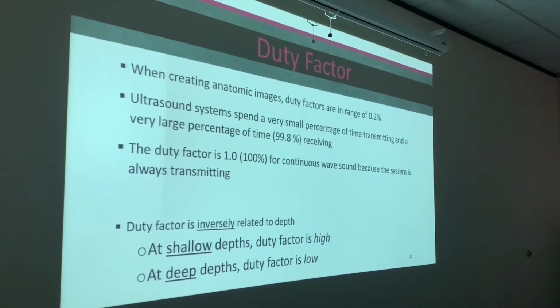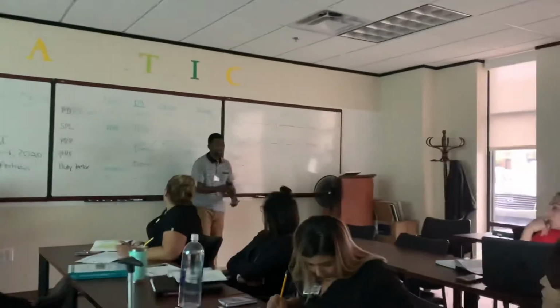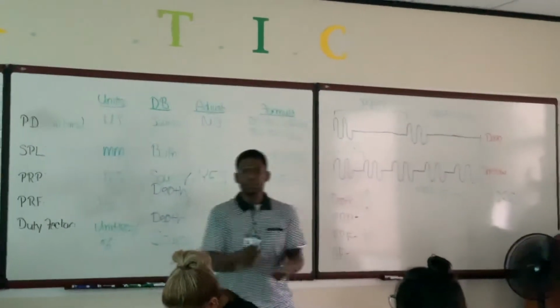Is it adjustable? Yes, because when we change the depth, we're affecting the duty factor as well. Because when you change the listening time, you're changing the percentage of the transmit time, or the pulse duration, versus the pulse repetition period. Just look up here. Look how short our pulse repetition period is. The duty factor will be higher. I always call duty factor the working time. I always say the transmit time is how much the machine is working.